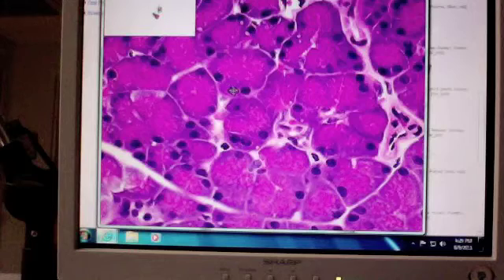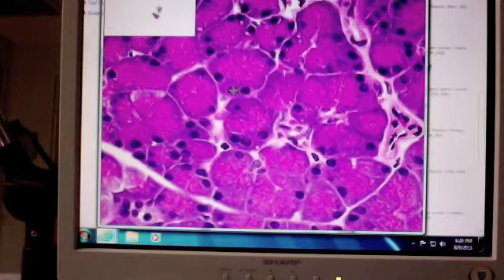Fibroblasts have those flat nuclei, but if you imagine squishing a nucleus flat, that would be a fibroblast nucleus, and it is still about the same size. It just happens to be longer and much skinnier, all right? So even at this magnification, a simple gland should only fill up not even a quarter of this area.